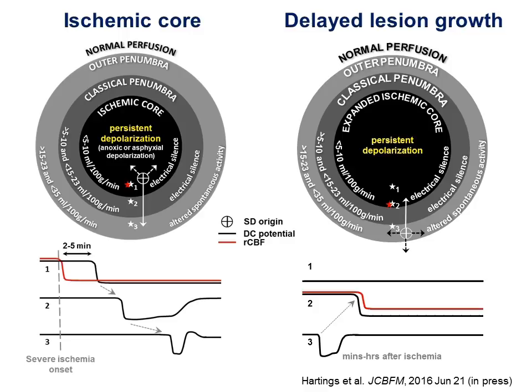And as far as presentation in the scalp, I'm talking now about seizures that we observe on the ECoG strip. The majority of those that we see are not manifested on the scalp.